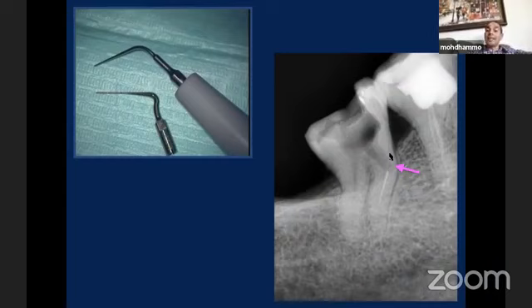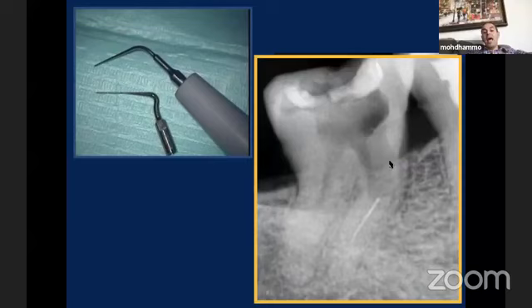Unfortunately, our colleague did not stop at this point. He continued removing the dentine to remove the broken instrument, and unfortunately, the tooth was completely destroyed. You can see here, a lot of dentine was removed, perforation occurred, and unfortunately, this tooth is very difficult to save. So we lost the tooth because our colleague did not know the rule of removal of a broken instrument: visibility.